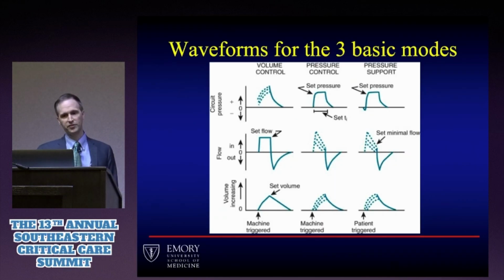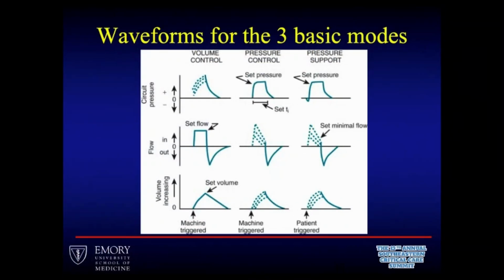So these are the three modes. I took the first one as the schematic that you saw earlier, but these are the three basic modes: volume control, pressure control, and pressure support, that we most often use, and each of them has those three phases.